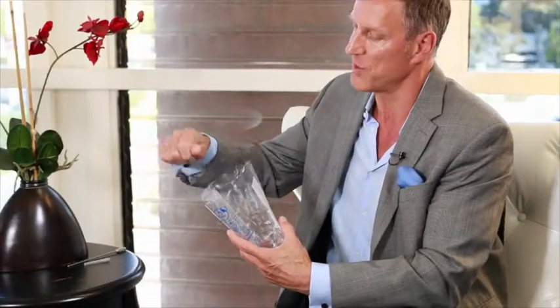There's some exciting data that may come out down the line that show that capsule contracture rate may be decreased by using the Keller Funnel. It hasn't been conclusively proven yet, but I always tell people, even if that doesn't come to pass, there's still so many reasons I would use the funnel, even if the capsule contracture rates stay the same. I can take this funnel and pour the implant into it essentially without having to touch it with my hand. So right out of the sterile package that it comes in from the manufacturer, pour it into here, close that up like this so I don't even have to touch it.